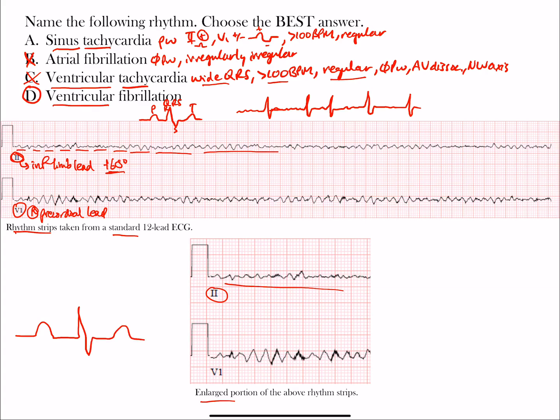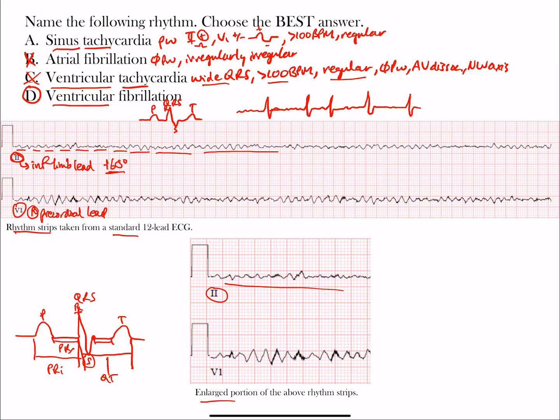Let's quickly run through the normal ECG complex. This is the P wave. This is our QRS complex — called an RS complex here because there's an R wave and S wave. The R wave is the first positive deflection of the QRS complex. The S wave is the first negative deflection below baseline after the R wave. This is the T wave. Here is the ST segment and J point. This is the QT interval, the PR segment, and the PR interval.